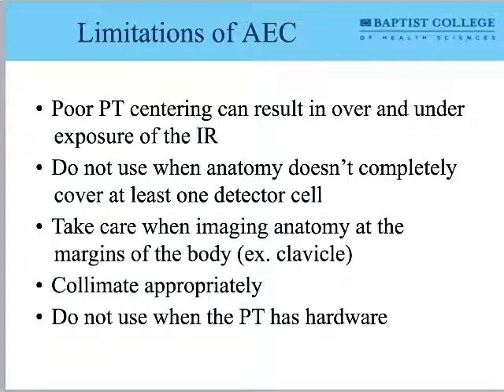So here's what I got on this one. But be aware, if you see a machine that's consistently shooting low or consistently shooting high, something's going on with the AEC nine times out of ten.